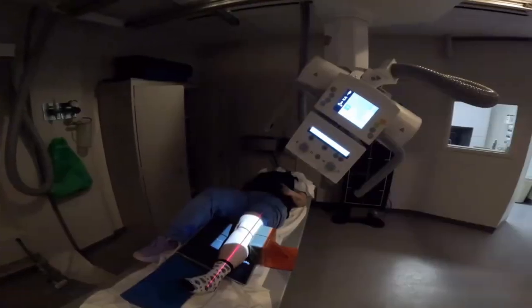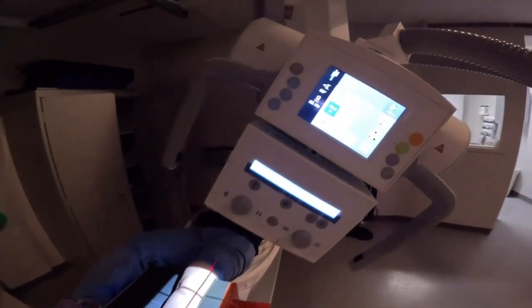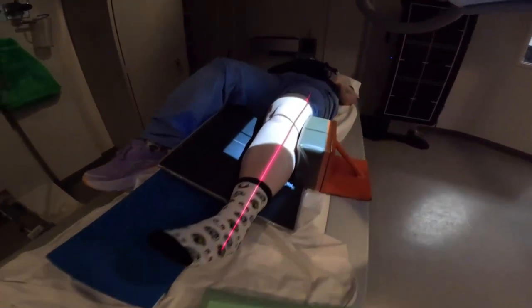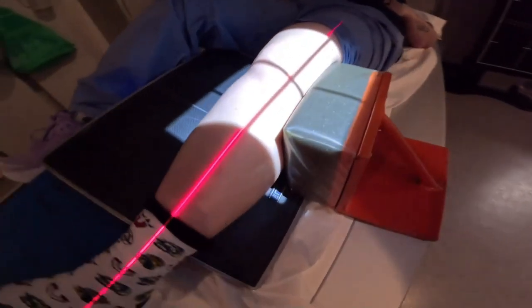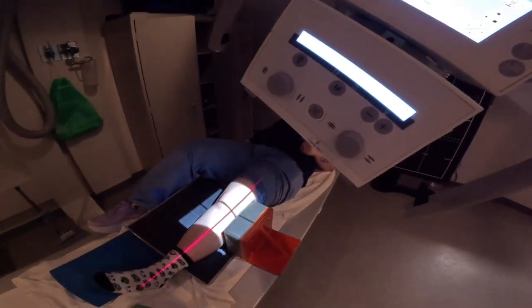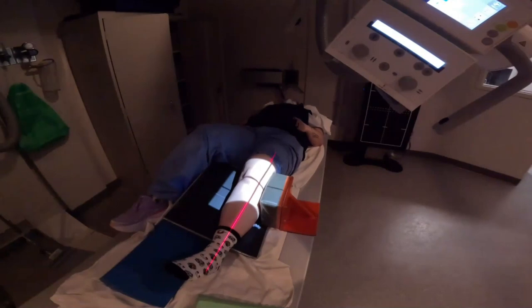So the main goal of this is going to be to match our tube angle with our image receptor. That's how we're going to eliminate distortion here. So you can see I got my tube angled in, and I have my board also angled to match. See, you can place something underneath the foot for comfort, but you see our central ray is going to be entering right there where an internal oblique should enter. And we're going to eliminate the distortion there.